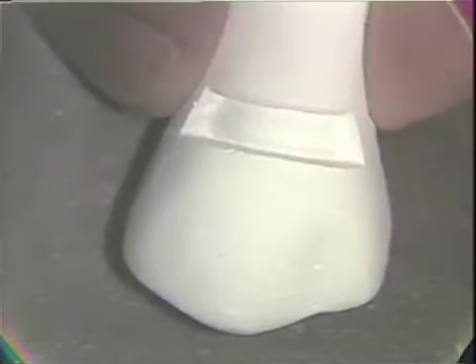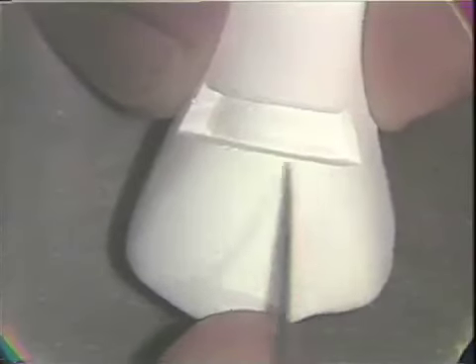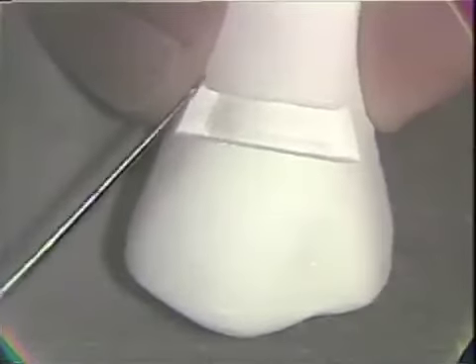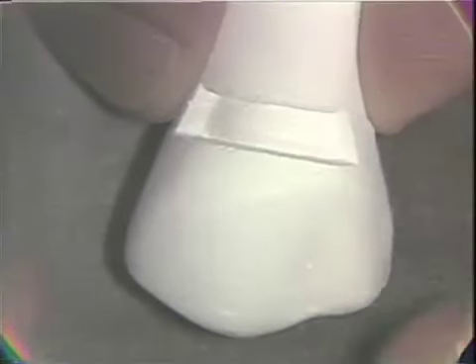A model of the preparation perhaps shows some of the features of the preparation a bit better. The Ferrier design, again, having the trapezoidal shape to it. The mesial and distal margins paralleling the mesial and distal line angles of the tooth. We see here some regularity and curvature to the axial wall position, depth, of course, that's sufficient to provide retention or area for retention form.